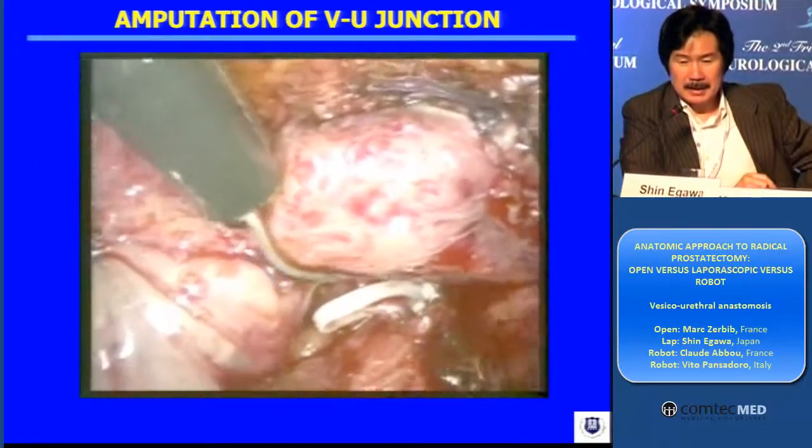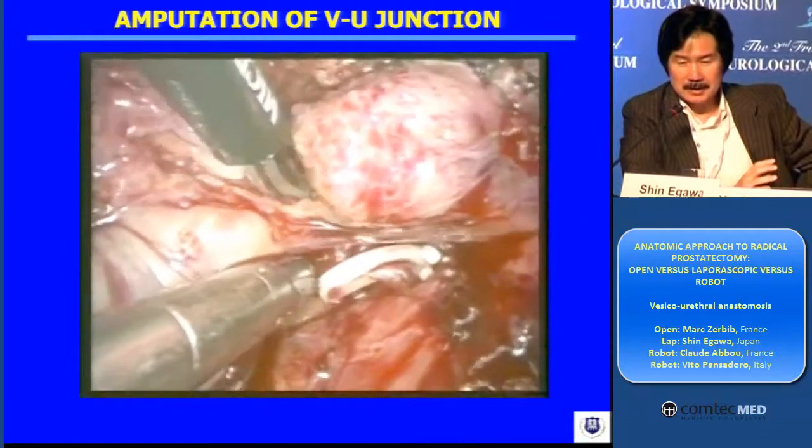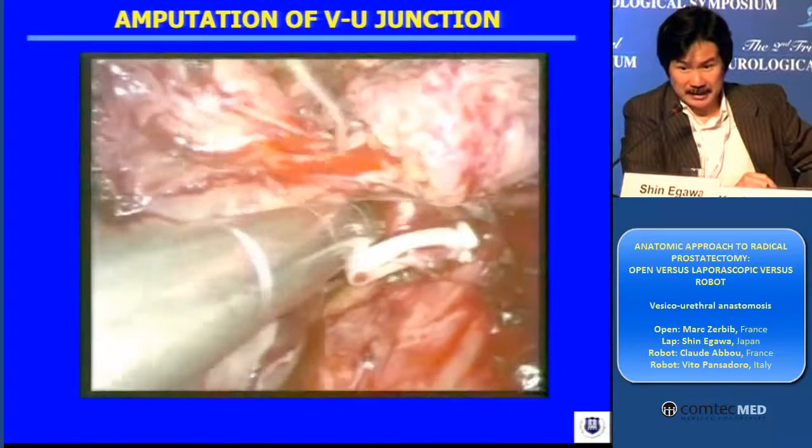And by placing the camera from a different port rather than the belly button, we can see the junction very clearly, as you see.